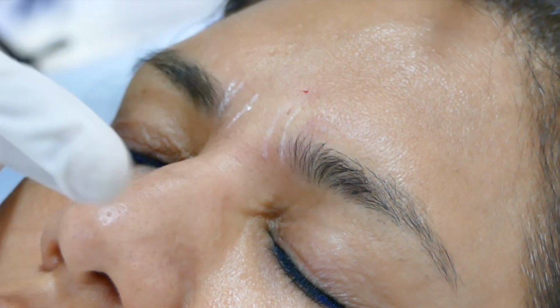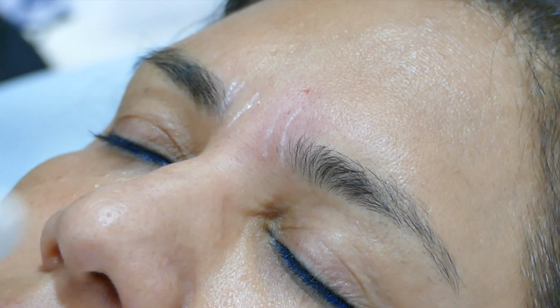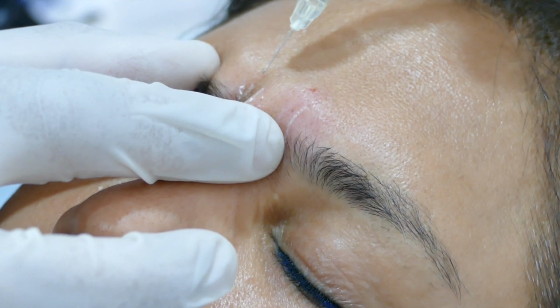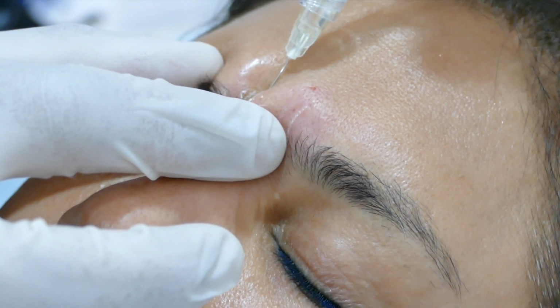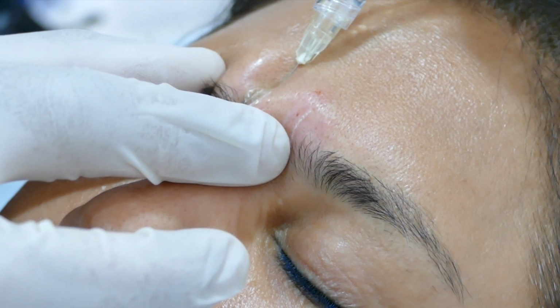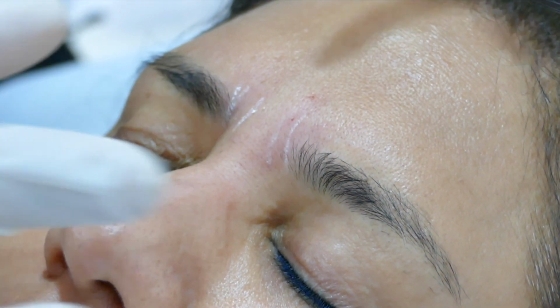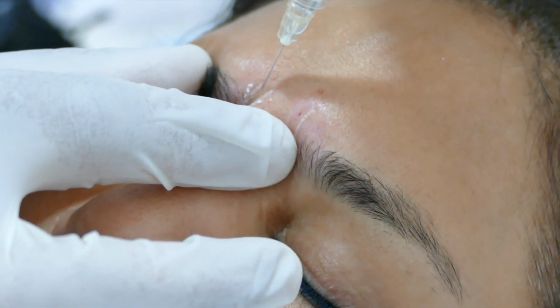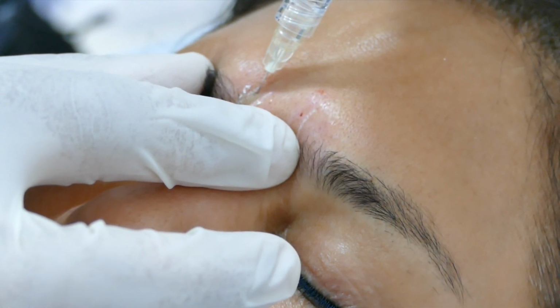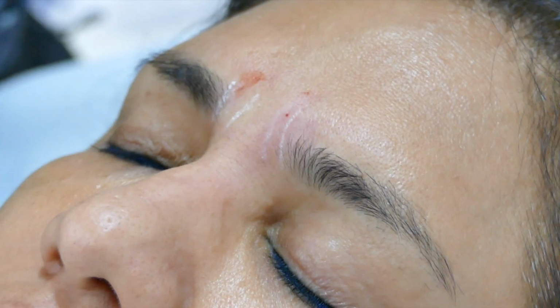That's it. Same thing on this side. Just pinch the skin and just subcutaneous. I'm injecting just 0.1 ml in the upper part and 0.1 ml in the lower part, and that's it.